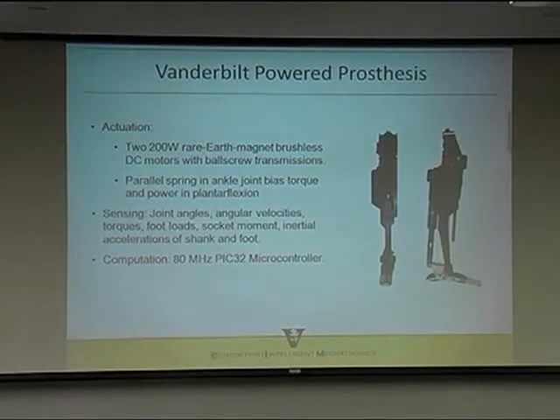Just by comparison, in your car, you have a transmission, which adjusts the motor torque to the wheel torque, or motor speeds to wheel speeds. And those transmissions are at the most about 3 to 1. These transmissions are about 200 to 1. So we have to do this really big transmission, and it has to be, of course, light and small and not have much friction. But we have those units, these are the muscles, so to speak.